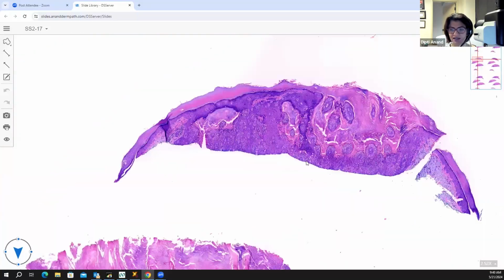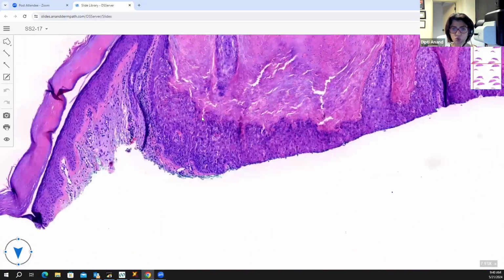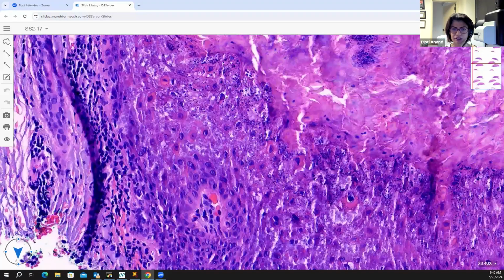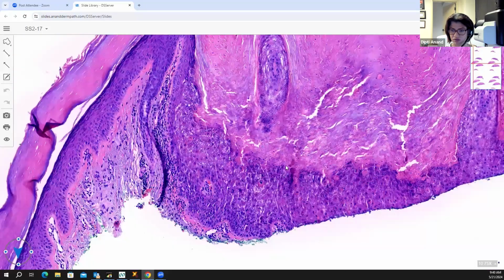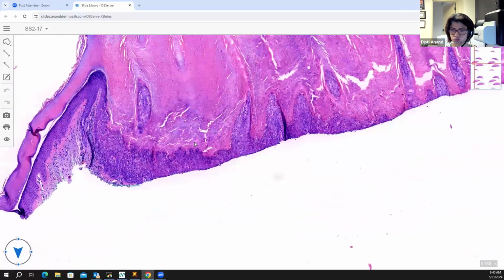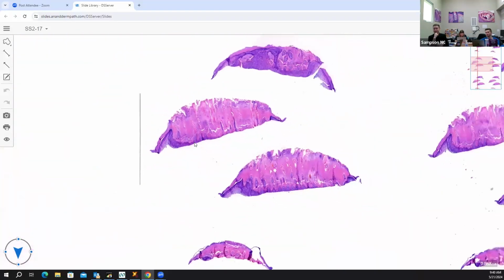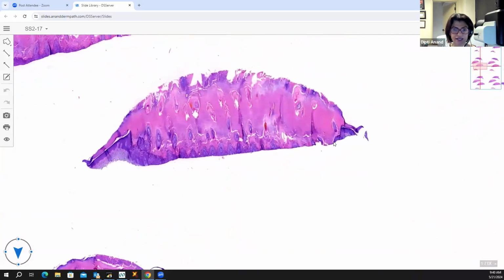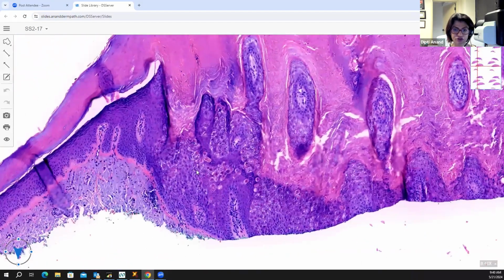What causes the pallor of the stratum spinosum with pink intracytoplasmic inclusions along with the prominent granular cell layer? You think of something like epidermolytic hyperkeratosis. Yep, this is EHK, and it will mimic a wart. That will be in your differential, and that's exactly how you will differentiate it.